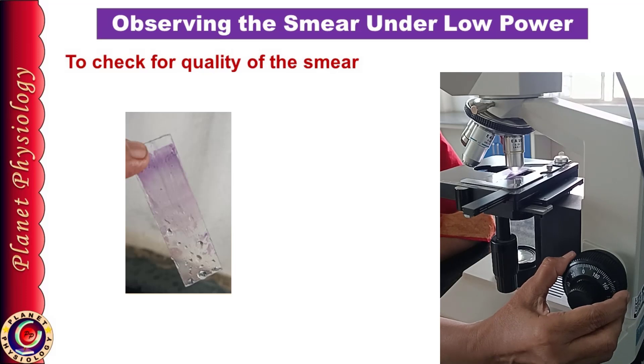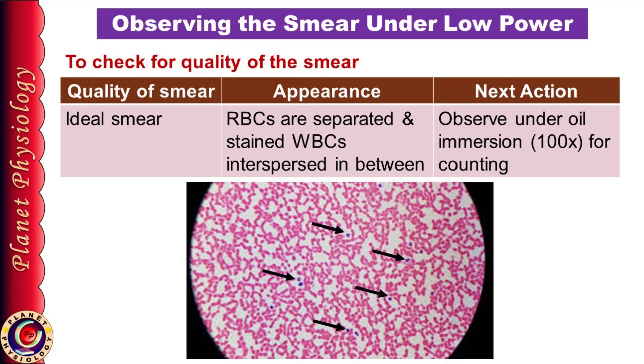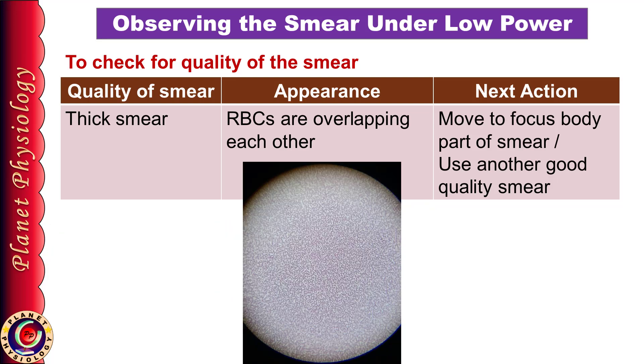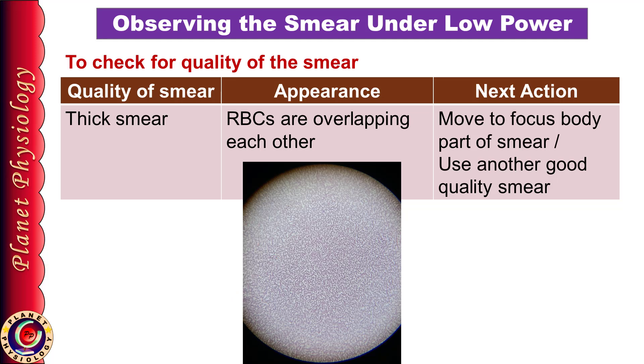Take your properly stained smear and observe it first under low power, i.e. the 10x objective. If your smear is thin and properly stained, you will see individual RBCs in the form of tiny pink dots in the entire field and few stained WBCs dispersed among them as indicated by these arrows. But if you find RBCs are overlapping each other, you may be observing the head end of the smear. In this case, just move your slide to get the body of the smear under focus. If the entire smear shows overlapped RBCs, it means the smear is thick and you should use another smear for counting the cells.